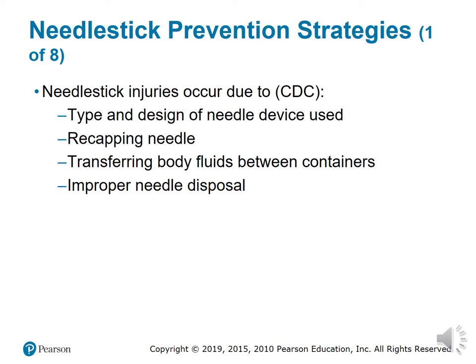If you're using a double-sided needle, after you remove the tube, invert the tube, place gauze over the site, and pull the needle out. Go ahead and activate the safety device by tapping it on the table. Do not use your hand, because you can easily stick yourself with the needle. The needle may be brittle. If you try to close it with your hand, you could break the needle off and stab yourself. There are multiple ways things could go. You just never know, so it is better to be safe than sorry.